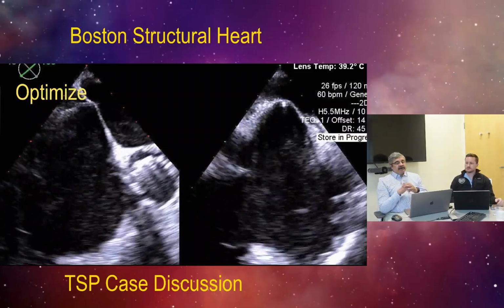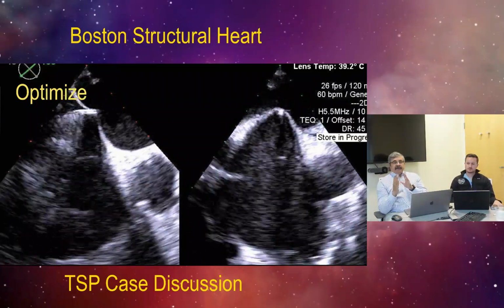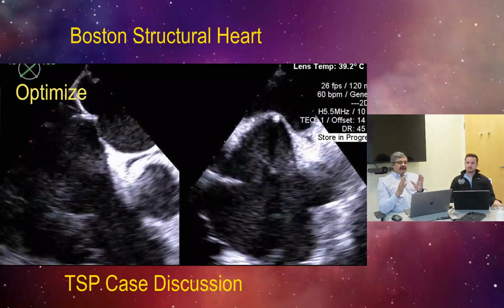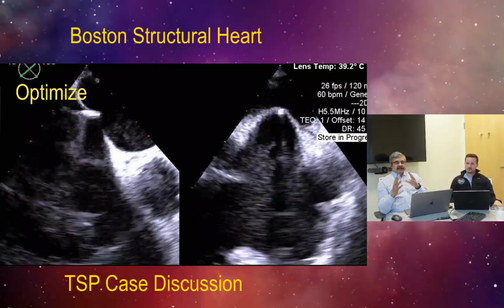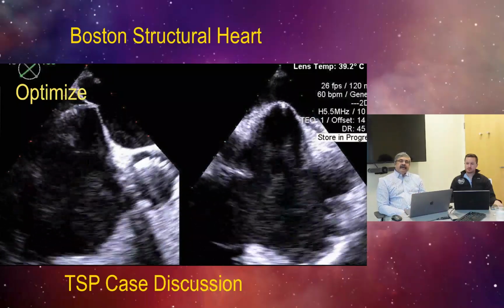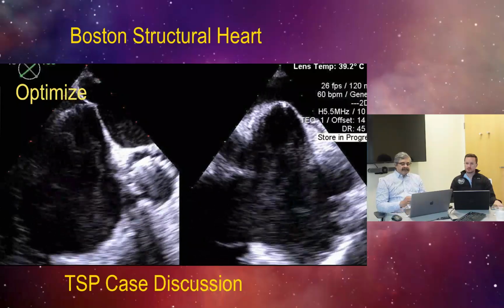This is a fine tuning of the septum to go superior, inferior, anterior, or posterior. This is where it's the most critical to maintain the continuity of the image, like Aidan said, not to lose it, not to have transitional images, because they're solely dependent upon this image of maximal tenting to optimize their septal puncture.